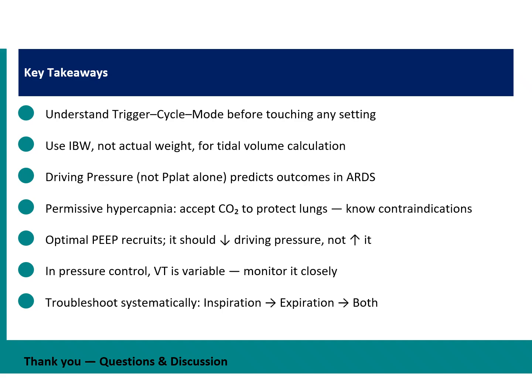The modes will not matter, whether it is volume control or pressure control. Both modes require thorough understanding of what you are doing. If someone says the patient was on volume control, he deteriorated, I switched him to pressure control, and after that he improved, then you have to understand that the person telling you is not understanding something he should have understood. The mode of ventilation doesn't matter, except in very rare situations, where also it is more about comfort rather than the mode changing the prognosis of the patient.